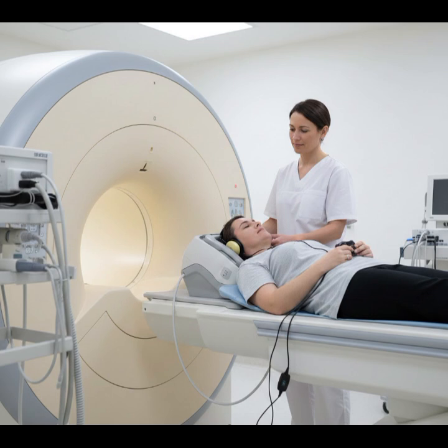Diffusion sequences provide additional insight. B0 images resemble T2 weighted appearance. Higher B values, for example, B500, B1000, highlight restricted diffusion as bright areas. On the ADC map, restricted diffusion becomes dark.